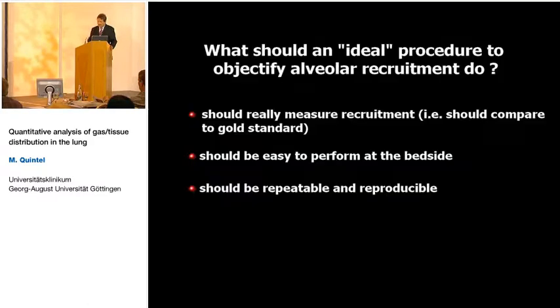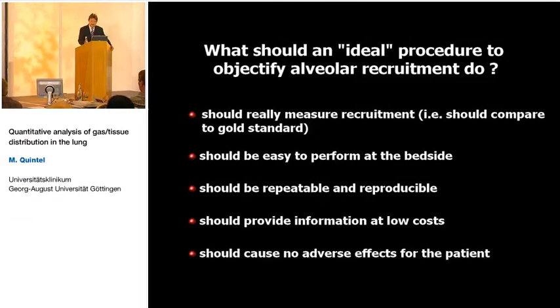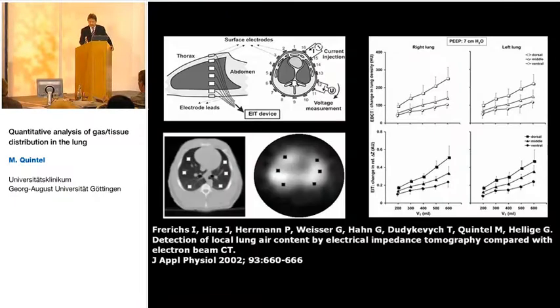It should be easy to perform. It should be repeatable and reproducible. It should provide information at low cost. This is also an argument if we talk about CT scanning. And it should cause no adverse effects for the patients.